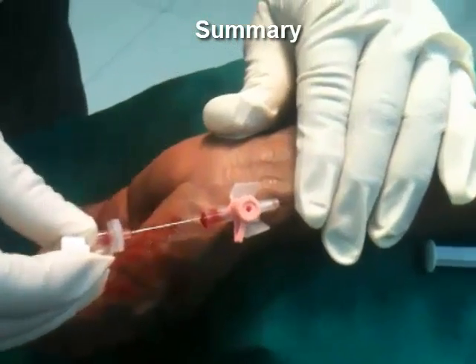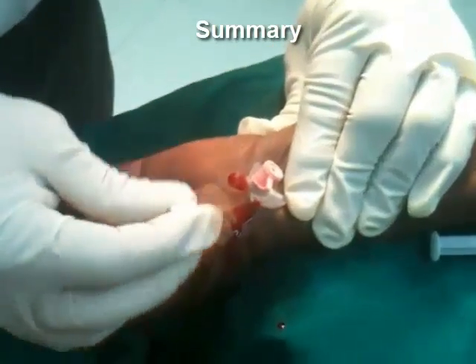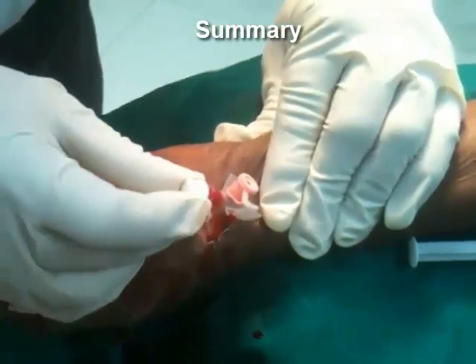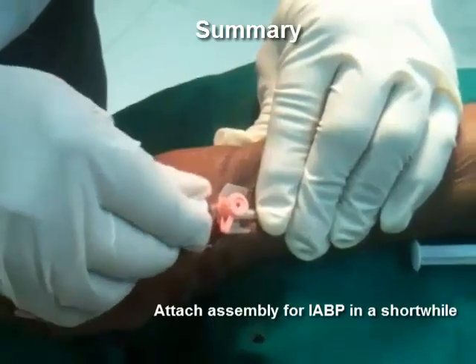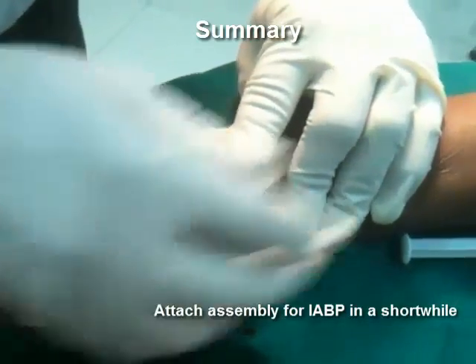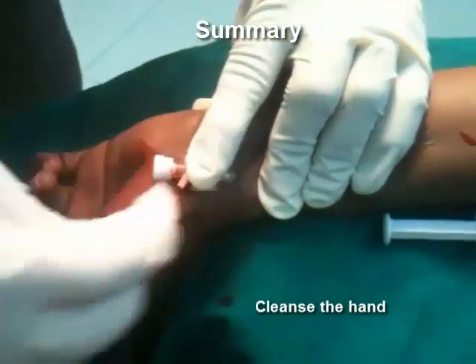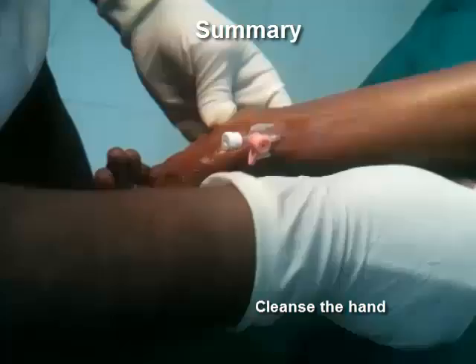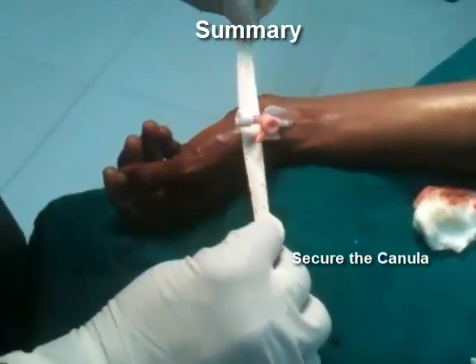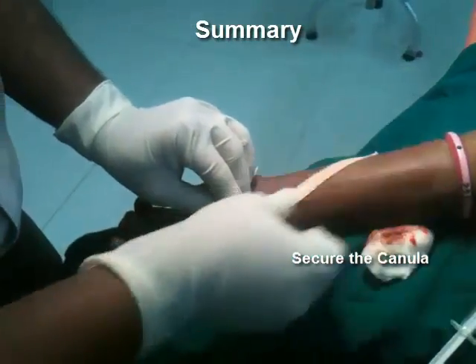Always take care to maintain sterility — it is of utmost importance, otherwise it can give rise to infections. Block the port of the cannula which avoids inadvertent injection of any drugs, whether accidental, unintentional, or intentional, which may result in complications that are very lethal to the patient.